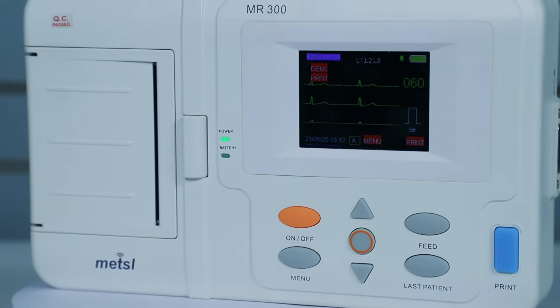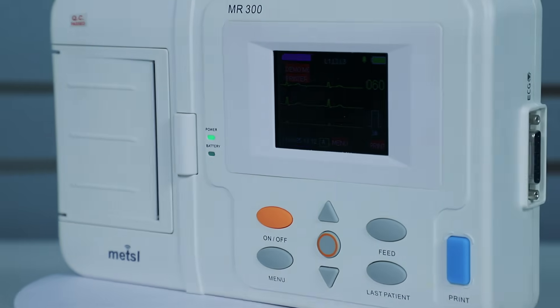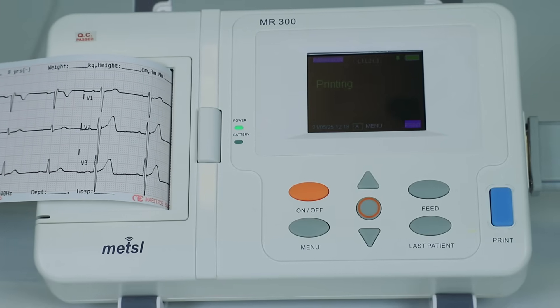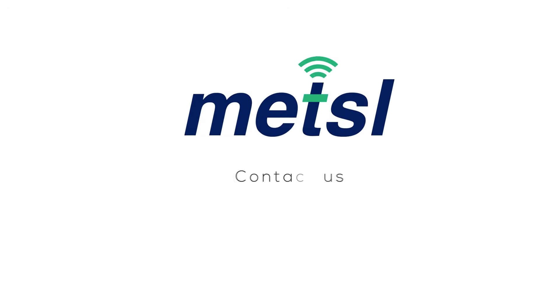Thank you for joining this demonstration of the Maestro MR300 Mini Machine. We hope this overview has highlighted its ease of use, compact design, and comprehensive features. For more information, please visit our website or contact our sales team.